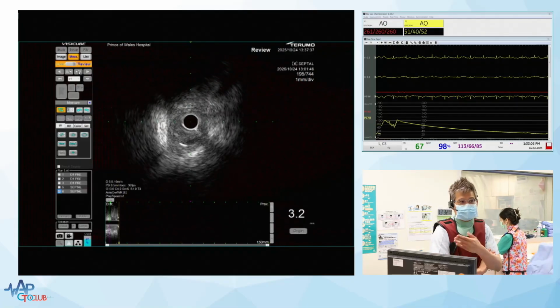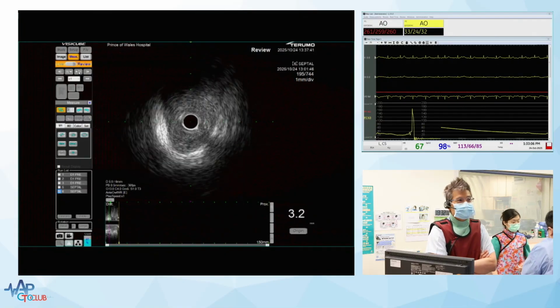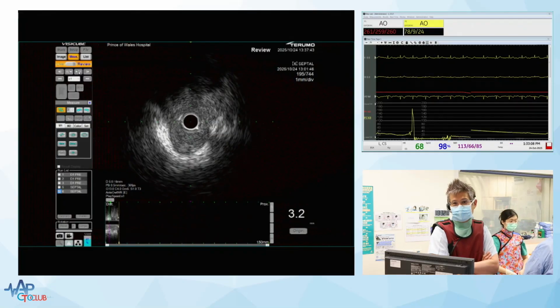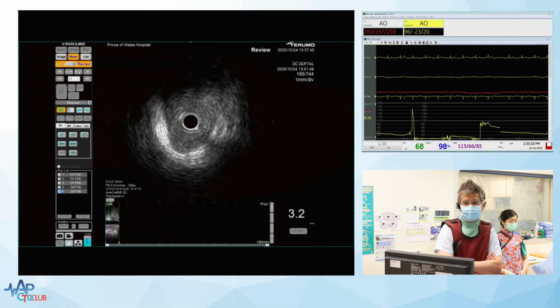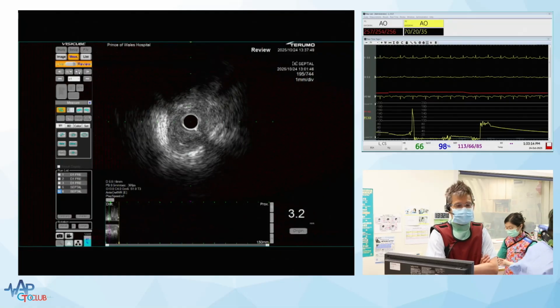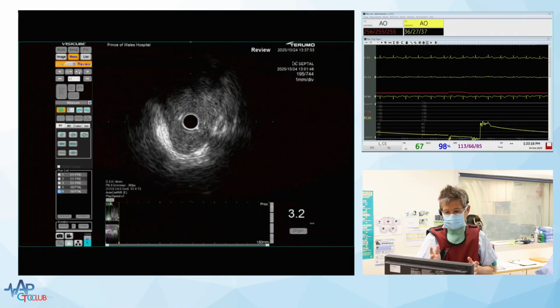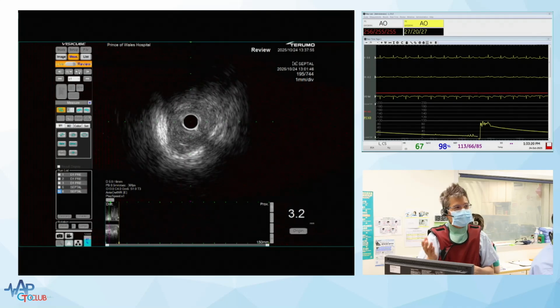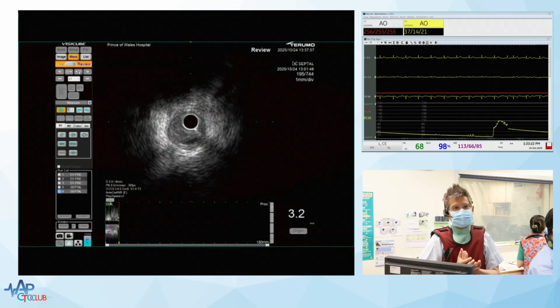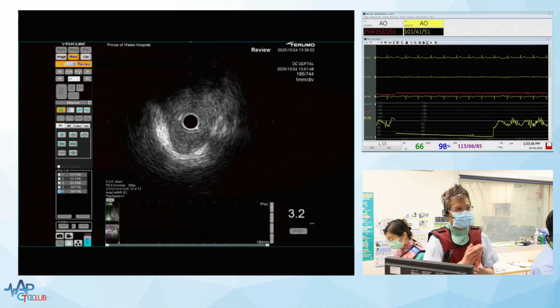So I think your suggestion now is you can see it from the septal. So I guess your opinion would be to do antegrade puncture under IVUS for this, right? Yeah. I have one question for you. This cap doesn't look difficult. It looks like you can antegrade puncture this. When you get down, how many of you would use 3D wiring of some sort to wire the distal, fluoroscopic?